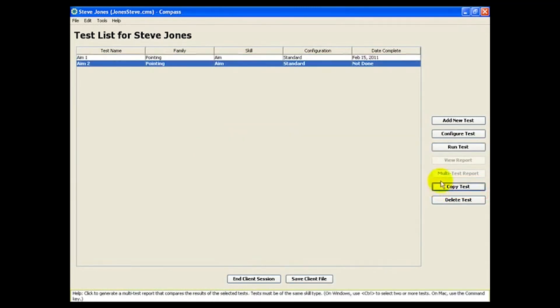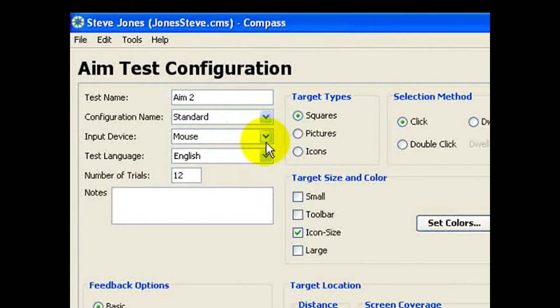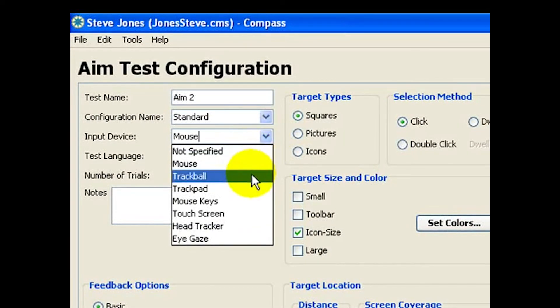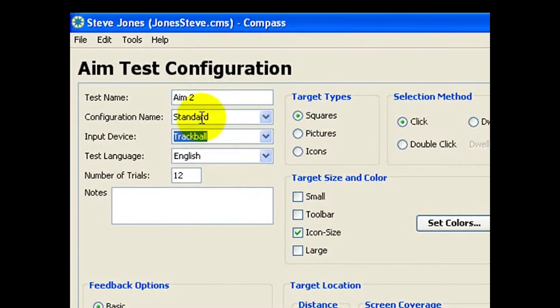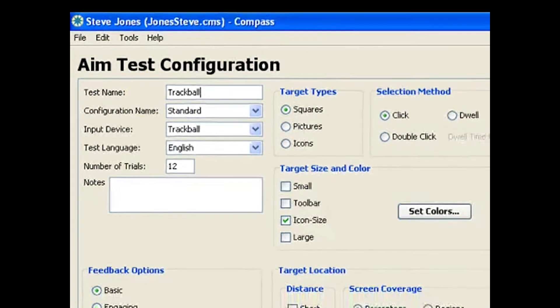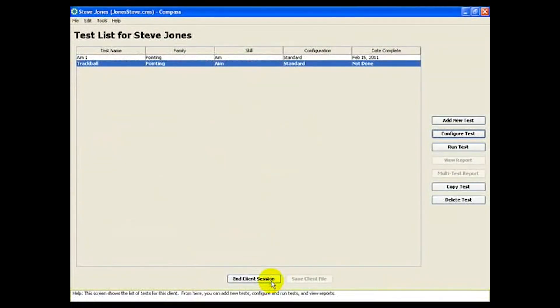Let's configure the new AIM test to show the use of the trackball. When Steve's ready, run the new test.